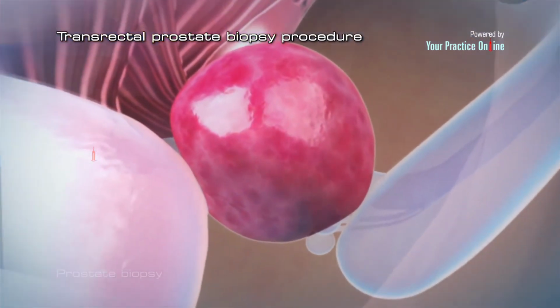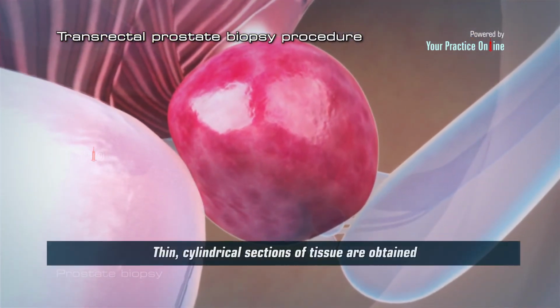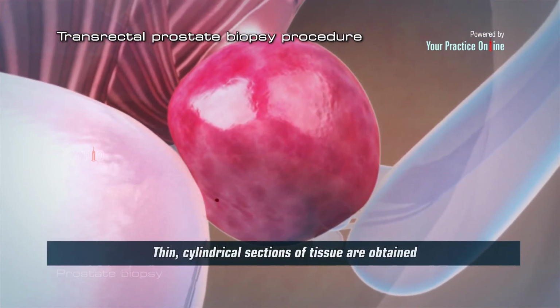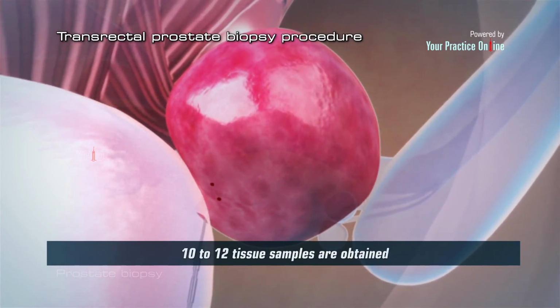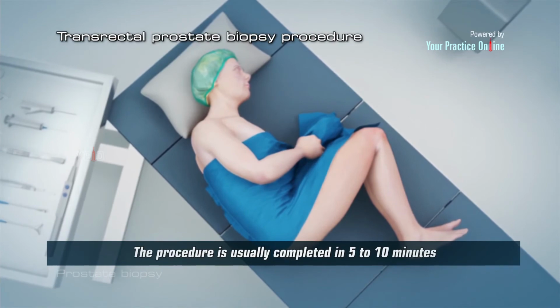After proper positioning of the biopsy device, thin cylindrical sections of tissue are obtained with a hollow, spring-propelled needle. Usually about 10 to 12 tissue samples are obtained. This may cause an unpleasant sensation for a short period of time while the samples are being taken. The procedure is usually completed in 5 to 10 minutes.